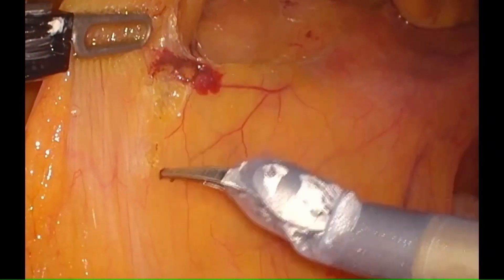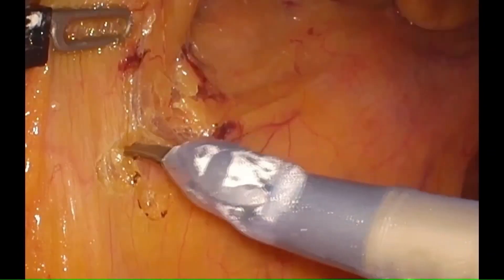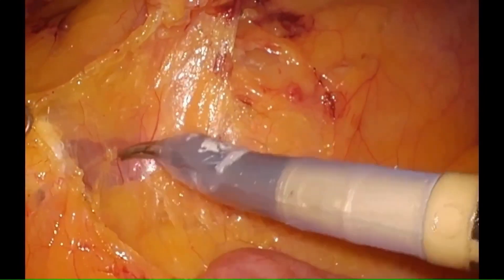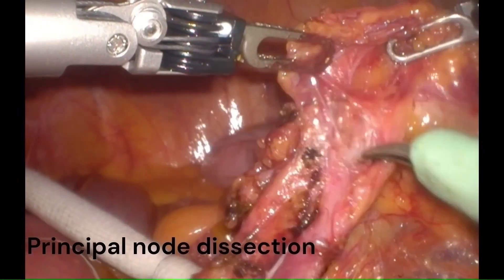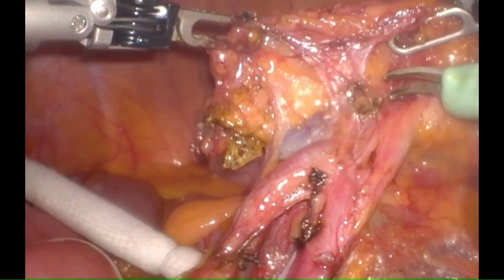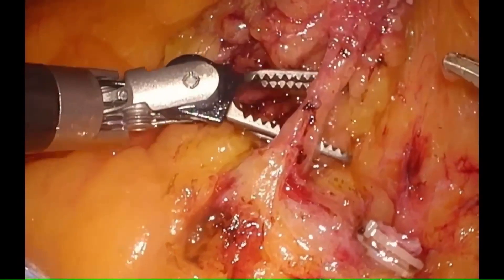We continue our dissection in the same plane, proceeding proximally to identify the lower border of the duodenum. After identifying the lower border of the duodenum, we do the principal lymph node dissection. The IMA can be ligated and divided at the origin or after the left colic, but principal lymph node dissection is important.